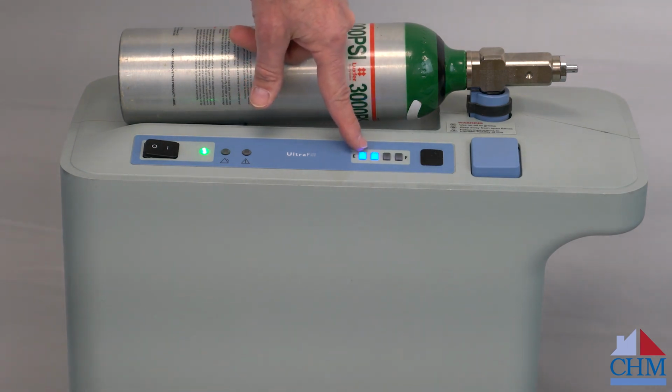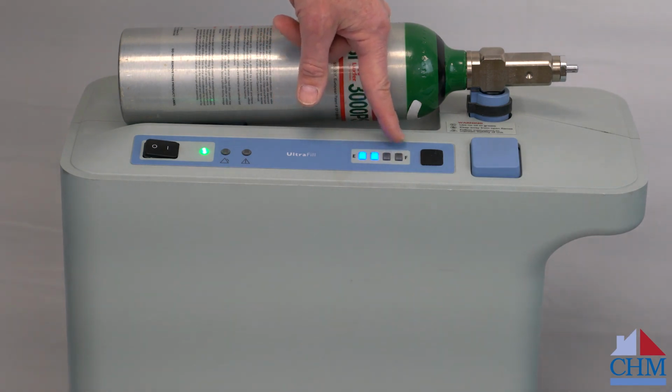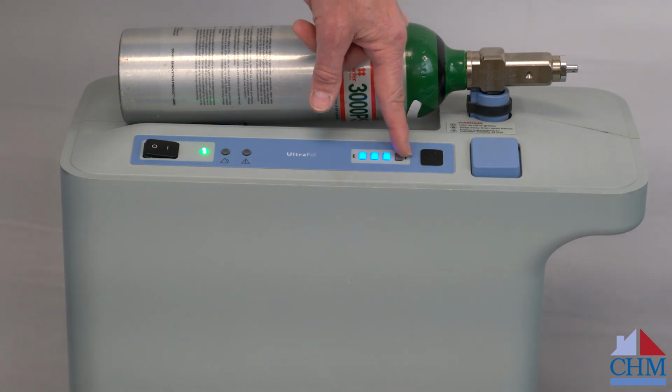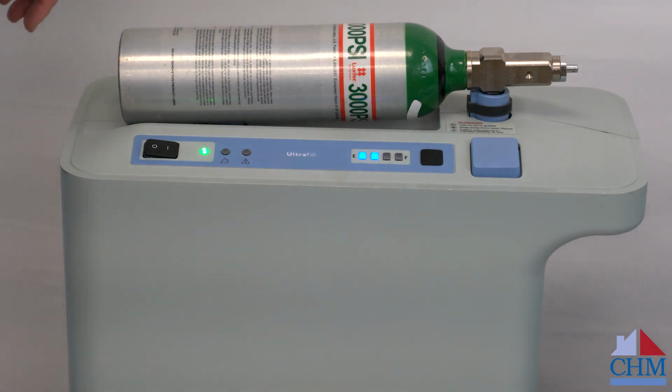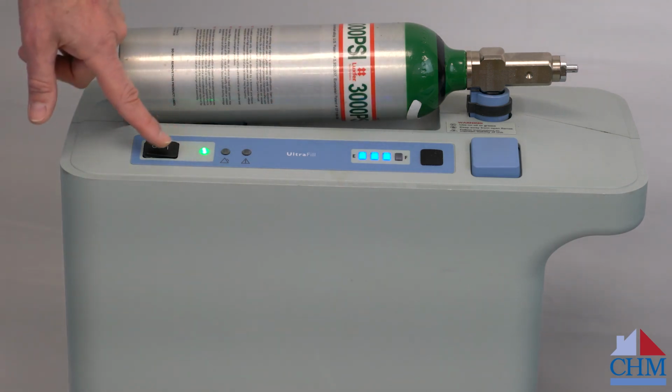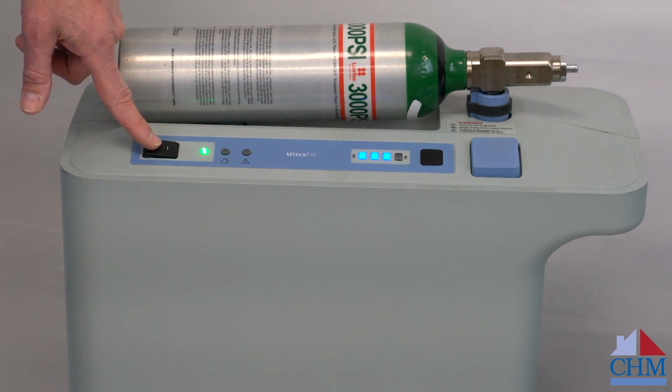Otherwise it would start here and it would take a couple of hours to get all the way to the full mark. When the last blue light is on at full, at the F right here, then the tank is full. The filling compressor part will stop at that point, so you could just leave it on. You don't have to be here the whole time and watch it. You can just let it fill. It'll quit by itself. This switch will still be on, but the filling process will stop by itself.